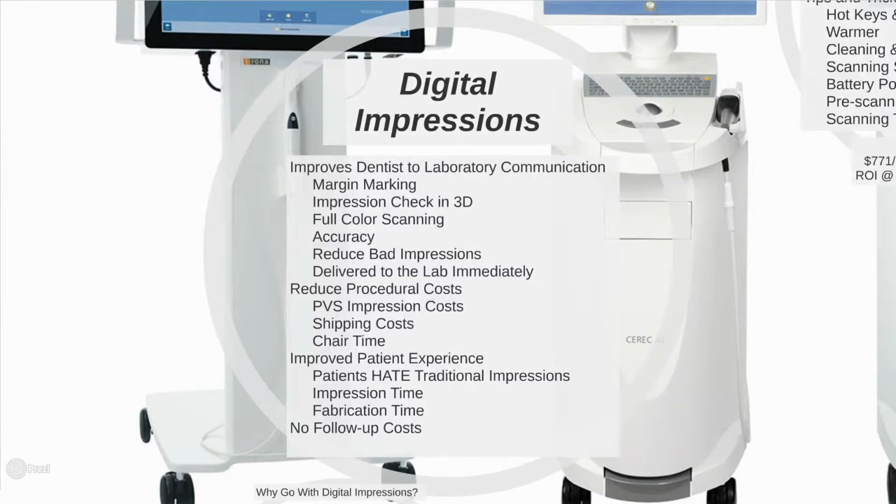One of the greatest benefits to digital impression scanning is that of the patient experience. Patients hate having traditional impressions. They don't like having all that goo shoved in their mouths. They also don't like having to sit there while the PVS impression goes through its curing process. Also, they might slip while they're sitting there in that impression process, which now distorts the impression.